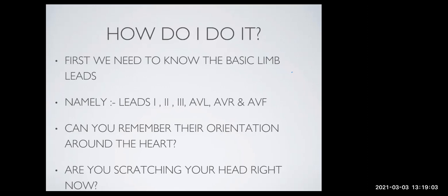All right, so let's say we've got our little man over here. Let's just draw him up over there. Let's make him a little stick figure. All right. Let's put his hands over there. Okay, and then we put his legs down at the bottom. All right, so this is our human being. So what we're going to do now is put the way we normally put the leads. All right, so let's try and get some things going over here. I think I'm getting the hang of this now.